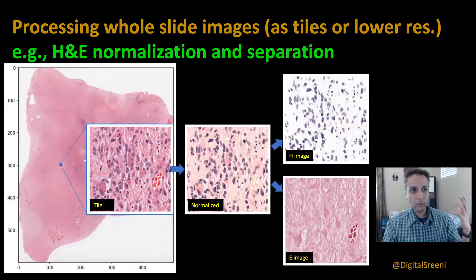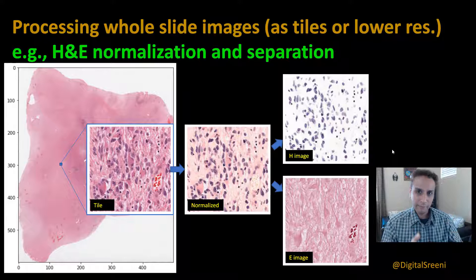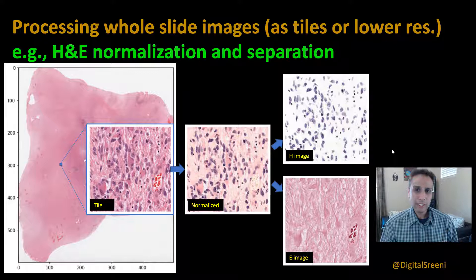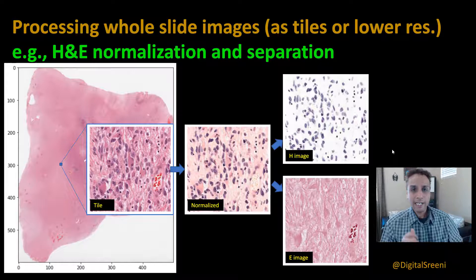You can use the H image, for example, to do nuclei size analysis using nuclei segmentation to segment individual nuclei and then do distribution and density analysis. The goal is: loading a large whole slide image, extracting individual tiles, doing some processing, and saving these. What I'm not going to cover in this video is putting the tiles back into a large whole slide image format, because you cannot just write into any whole slide image format. That's a different discussion.